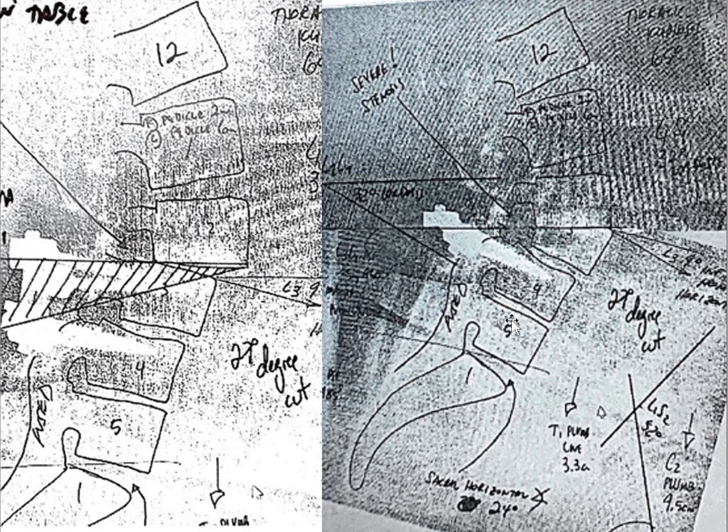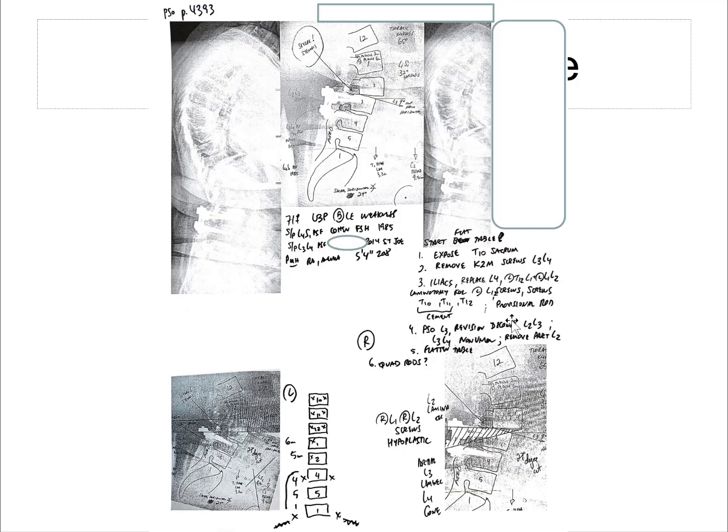In this patient, I felt L3 was the best place to put the pedicle subtraction osteotomy. The reasons are it's at the level of the non-union. I already had a good L4 pedicle screw. I mean, I did remove it and place a new one in and redirected it on the left, so it's a better screw, but it was pretty easy to do that. I wanted to decrease the time.